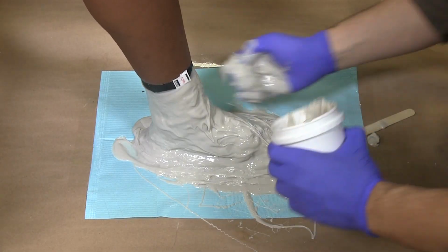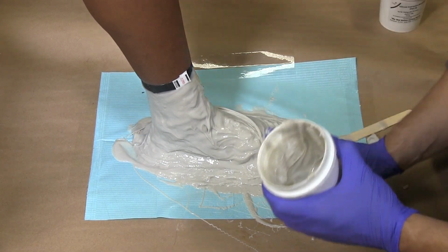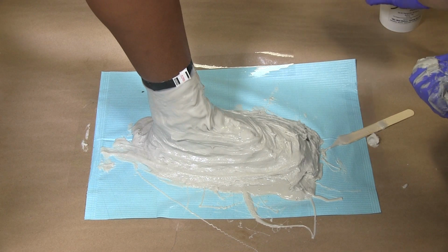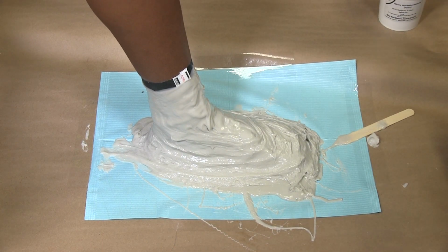Do not forget to apply impression material completely up to the ankle band. Enough length above the ankle is crucial in creating a proper prosthetic, and impressions that are too short may need to be remade.